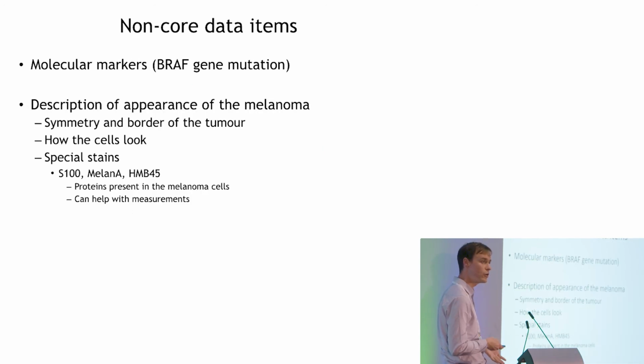In terms of the non-core data set items, this is where we can mention molecular tests if they have been done. This may change to be a core item in the future. Also a description of how the tumour looks, and special stains we use in order to measure the depth of invasion. Again, this will vary slightly from centre to centre.